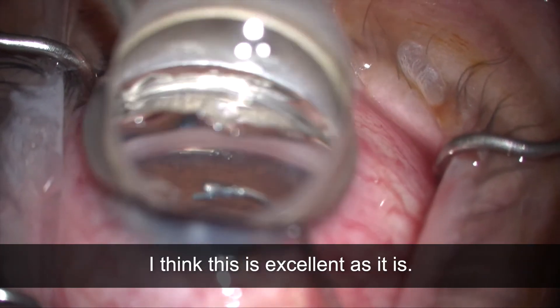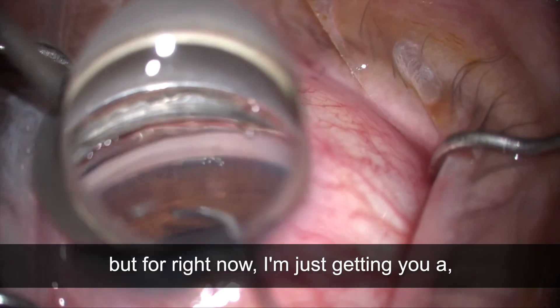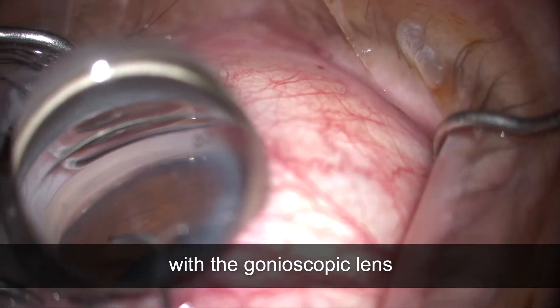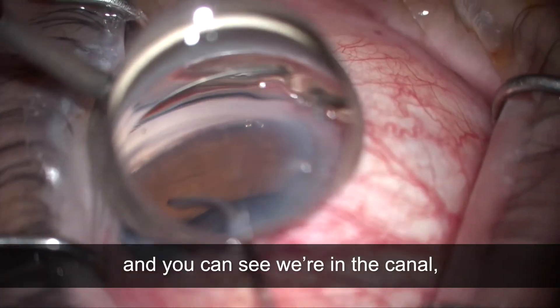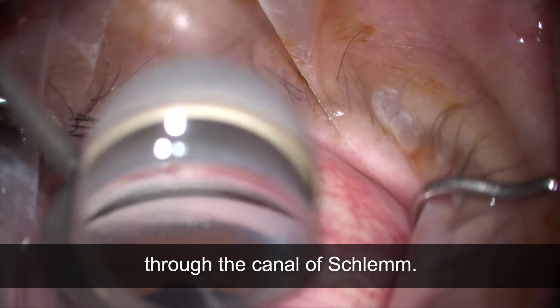I think this is excellent placement. I'll make a few manipulations, but right now I'm giving you an oblique view with the gonioscopic lens. You can see we're in the canal — you can see all the windows there through the canal of Schlemm.